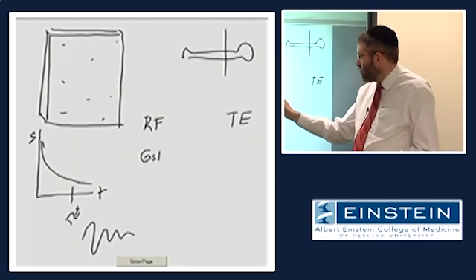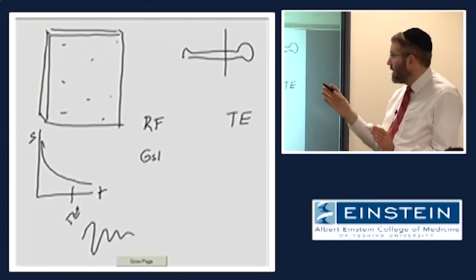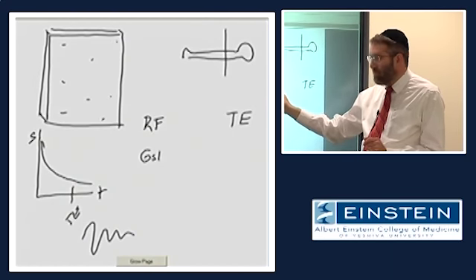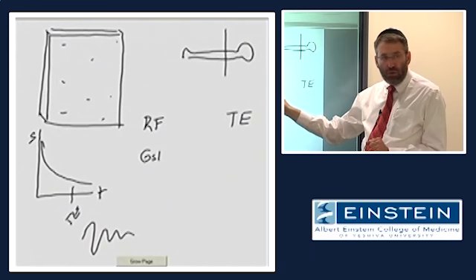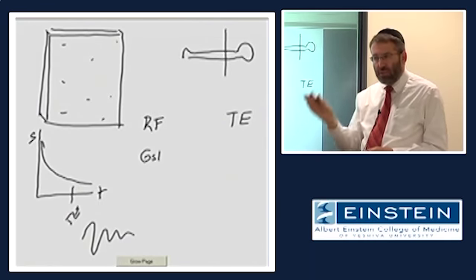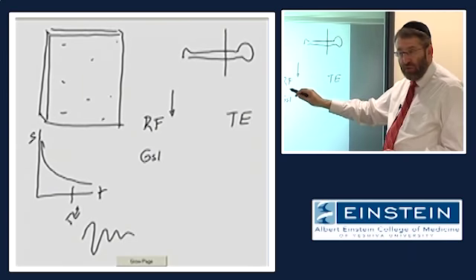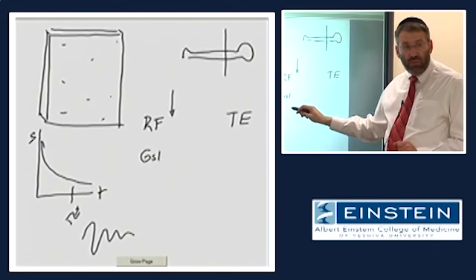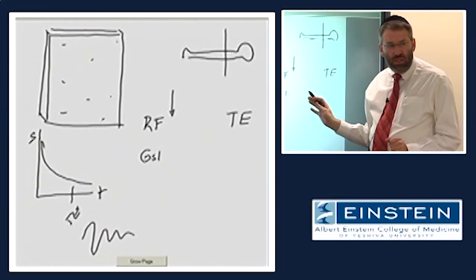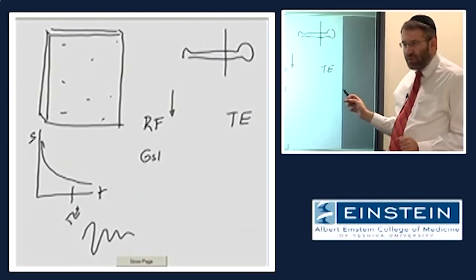So we turn on this gradient magnetic field, transmit the RF. While the RF is on, only the spins in the slice are precessing with a frequency that matches the frequency of this RF pulse. Therefore, only those spins become excited. At this point in time, we've turned off our RF, we've turned off this slice select gradient, and we're basically not doing anything to the patient. We're just watching the signal decay until we decide to sample it.